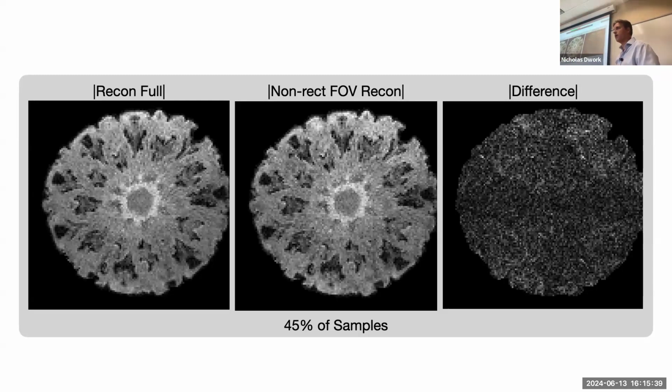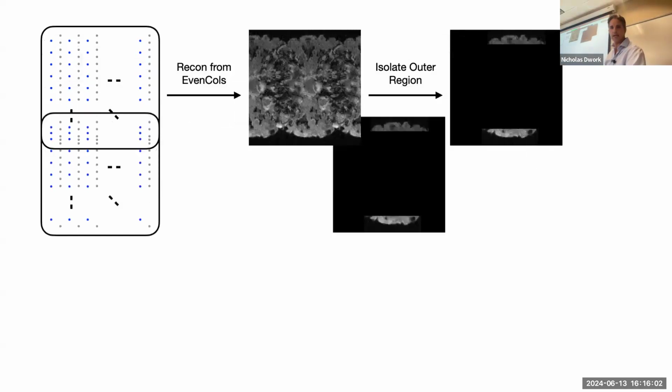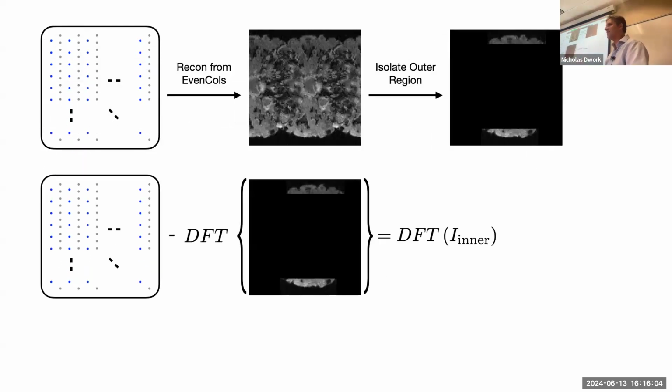Can you clarify why it's the same sampling pattern for the pineapple and the foot? Oh, no, it's a different sampling pattern between the pineapple and the foot. So I just meant that the blue dots are separated by the inverse of the distance of the inner portion of the pineapple. Oh, but I mean, same family of sampling. Yeah, let's say family. Yeah, same family.